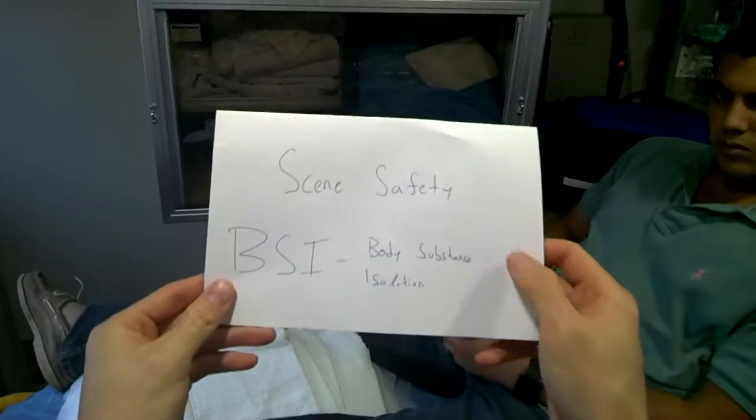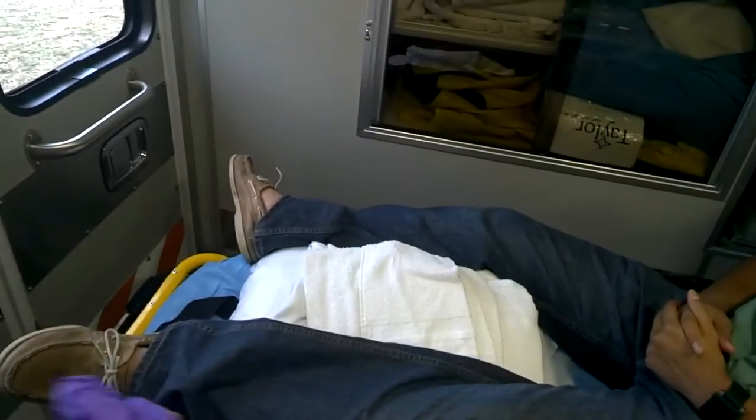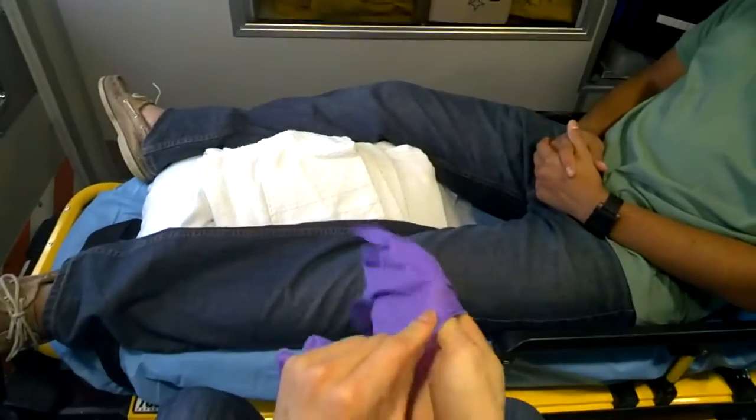Now, the first thing we do is scene safety and BSI. BSI stands for body substance isolation, so I will be isolating myself from harmful things that the patient could give me with gloves.